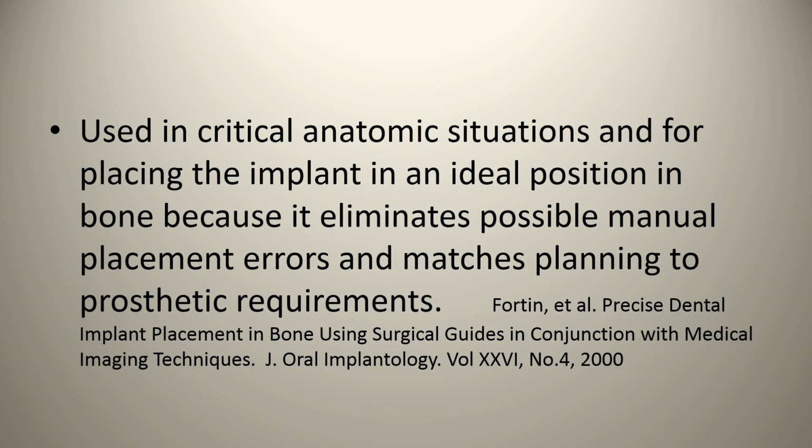So cone beam CT scanners or stents can be used in critical anatomical situations and for placing the implant in an ideal position in bone, because it eliminates possible, and the key word here is possible, manual placement errors and matches planning to prosthetic requirements. And this was a study which was proposed back in 2000.